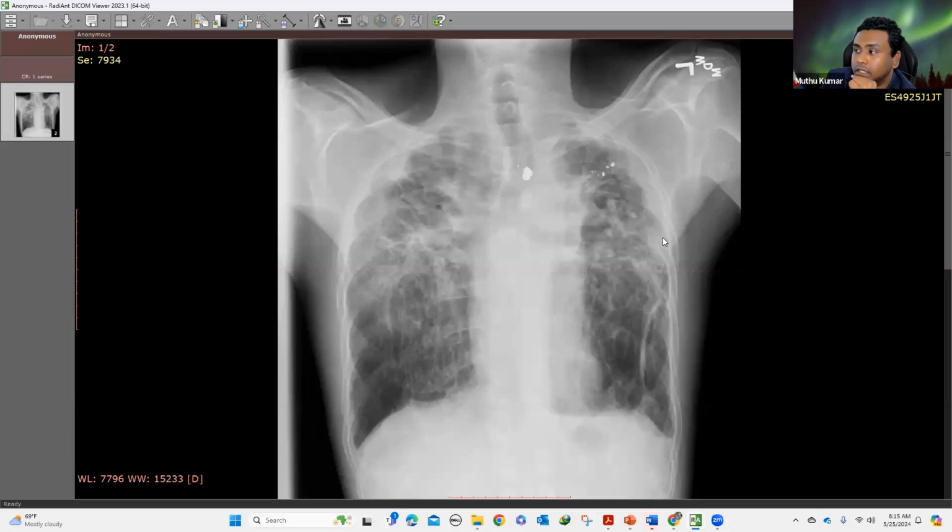The diagnosis is a little bit different. So what I'm going to tell you is, yeah, PPF is an excellent thought. Whoever said PPF is an amazing thought. You need to have a differential when you see mid to upper lung predominant fibrosis. We all know lower lung predominant fibrosis means we are going to call our usual suspects, idiopathic interstitial pneumonia that includes NSIP, UIP, and its cousins.